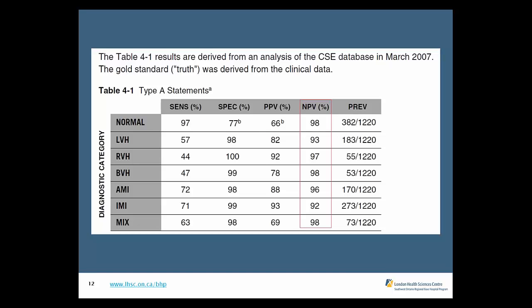At the end of the day, the take-home message is that it will overcall and will not undercall. Well, it will undercall a little bit, but again, that's where your interpretation and knowing the patient in front of you come in. And I think with what you're faced with in the undercall, you're probably not going to miss any STEMIs.